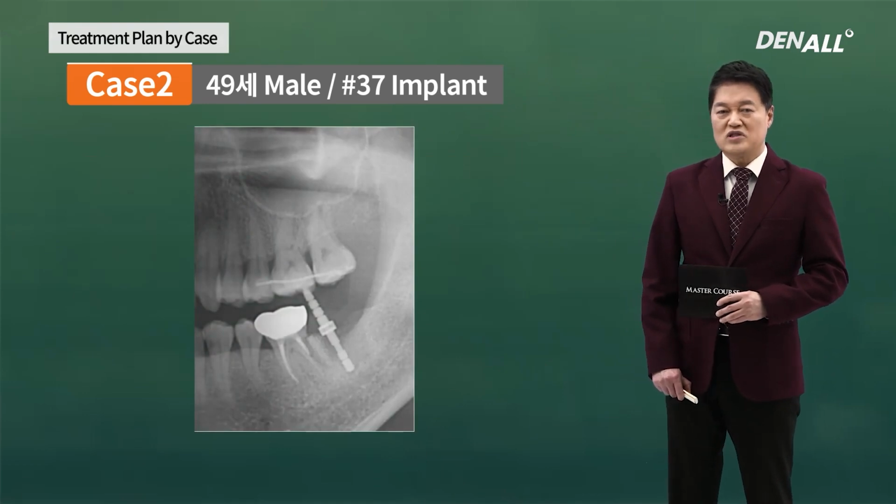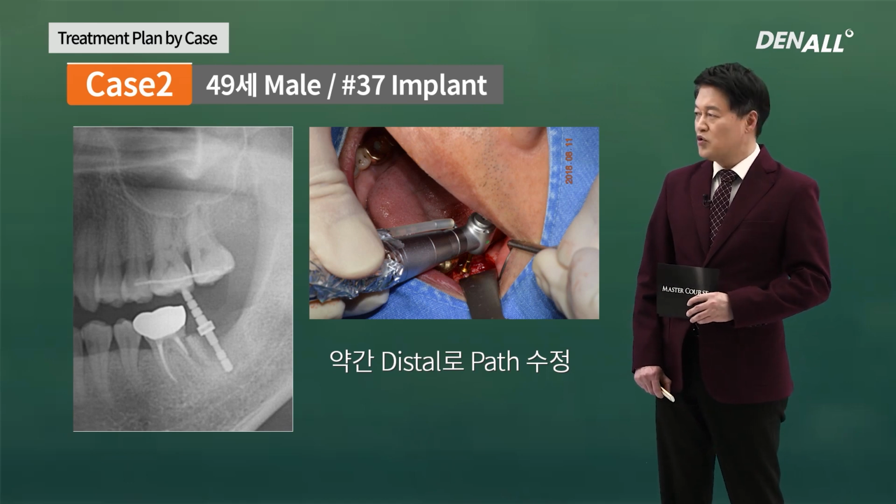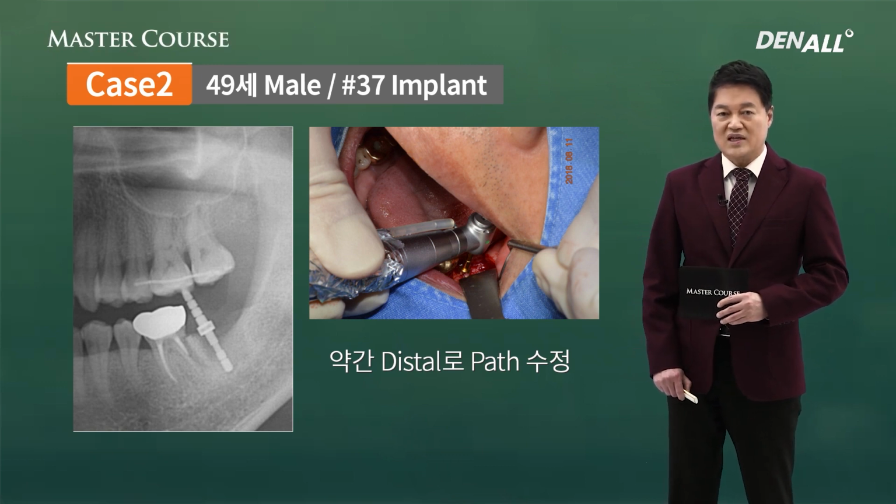It is slightly tilted to the mesial. The path is adjusted slightly towards the distal. The placement position is not that bad, so the path was just adjusted and drilling was done.